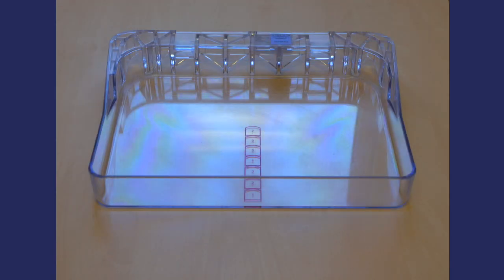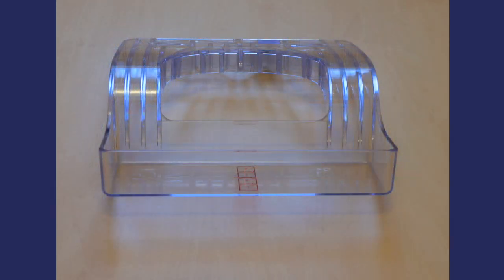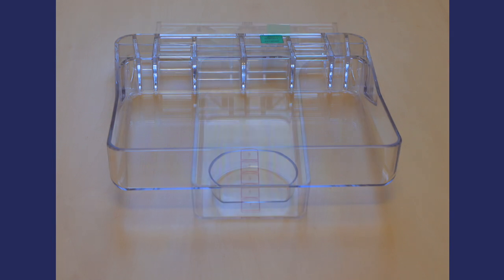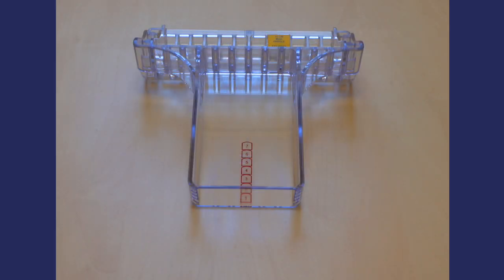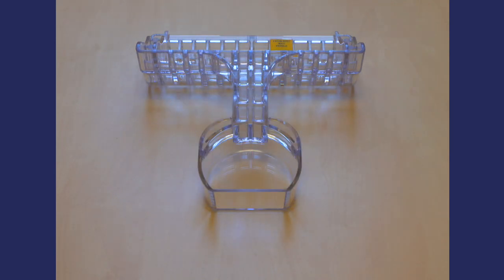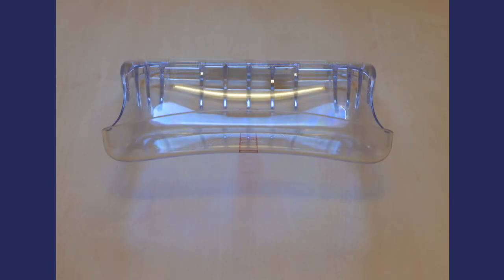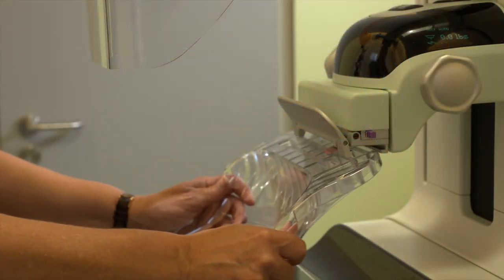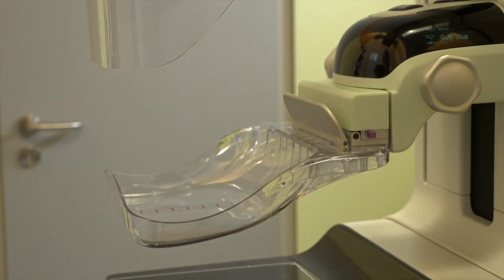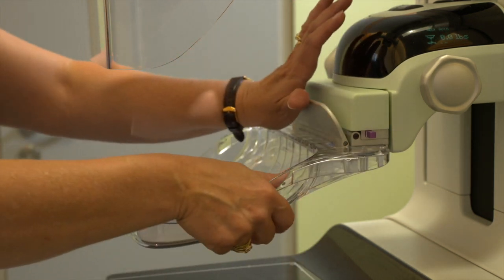With every 3D mammography system we have a whole host of paddles. We have three screening paddles, three compression paddles, two mag paddles, and our new smart curve breast stabilisation system. This new paddle is curved and follows the contours of the breast. Patients who have used this paddle have found it a much more comfortable experience.